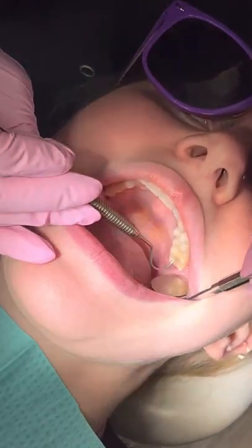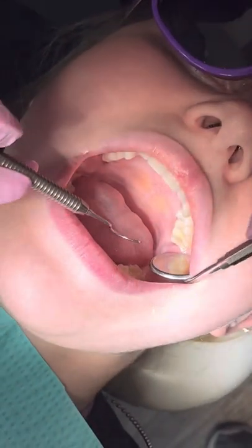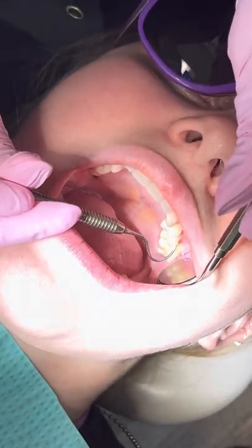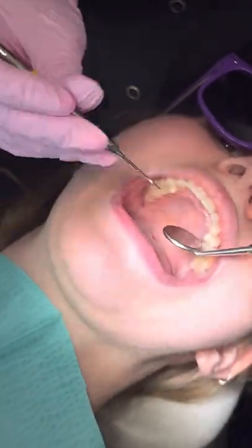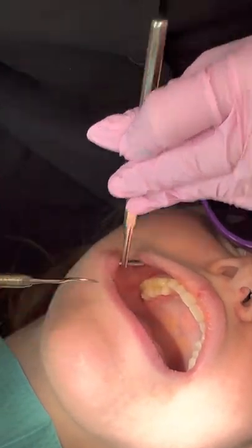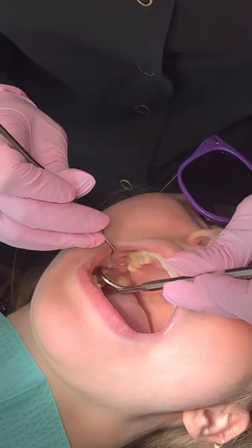Using my explorer, I scratch on the occlusal surface. I'm using direct eyesight and looking in the mirror to see those teeth. I go along those occlusal surfaces, then retract and come from the side so I'm able to see the buccal. I scrape those buccals because that is the most common area where people leave plaque. Then I come to the center, check the linguals, and see how those pits look. For the other side I use direct vision, pull the cheek and retract, scrape those buccals, and still check those occlusals using that swooping motion — never just pushing straight in. You never want to cut a child.